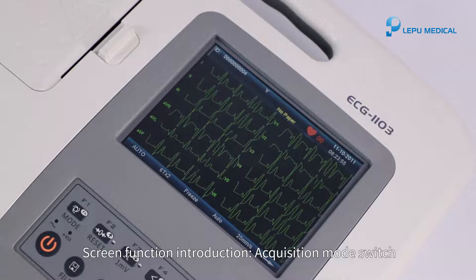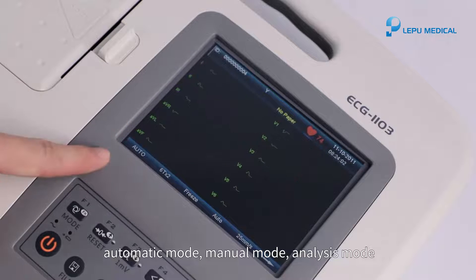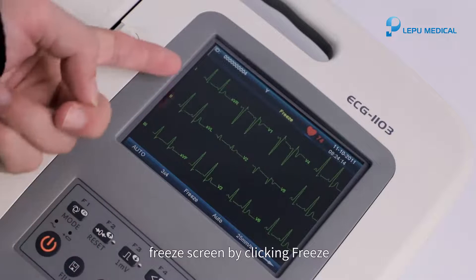Screen function introduction. Acquisition mode switch: Automatic mode, Manual mode, Analysis mode. Lead mode display switch. Freeze screen by clicking freeze.